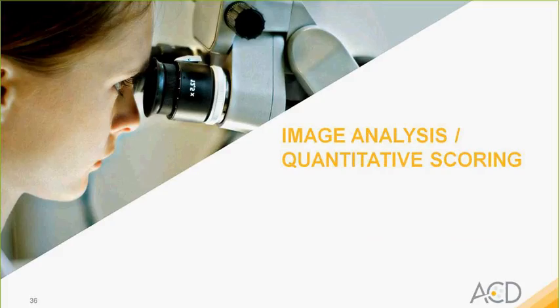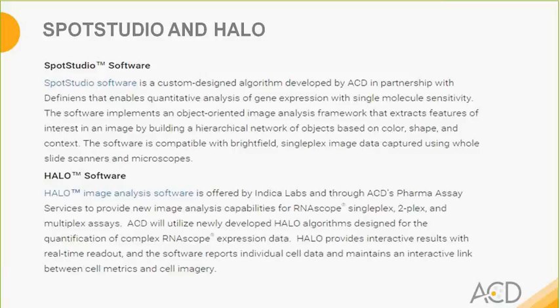Moving on to image analysis and quantitative scoring. ACD has and currently uses 2 main different software applications for quantification of RNAscope assays. There are other software applications available for so-called dot counting in assays like RNAscope and FISH, but the 2 that ACD typically uses are called SPOTSTUDIO and HALO.